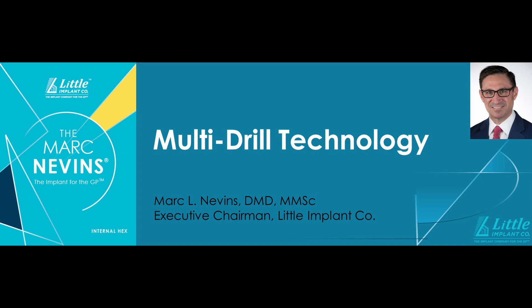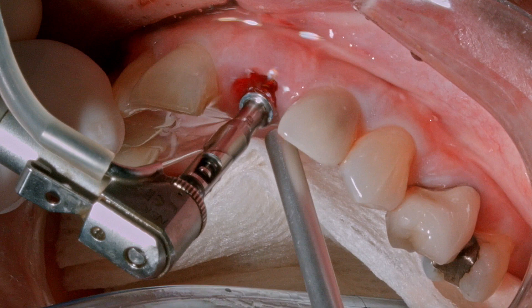I'm Mark Nevins. In this video we'll present the multi-drill technology of the Mark Nevins dental implant system through a montage of surgical implant placements.